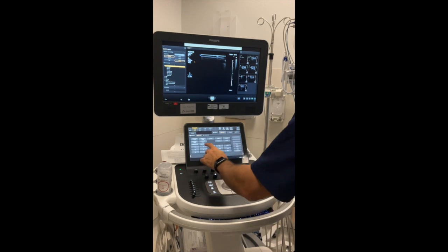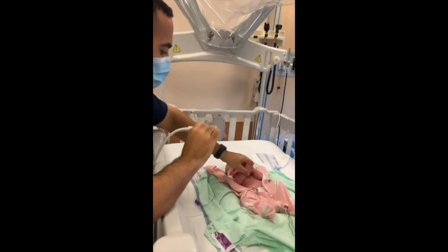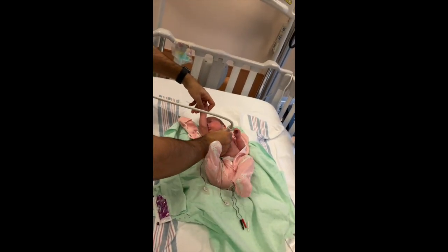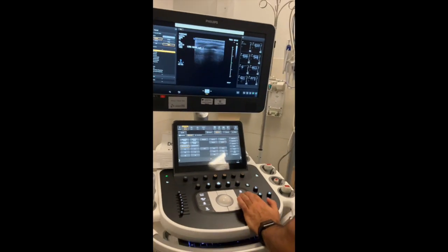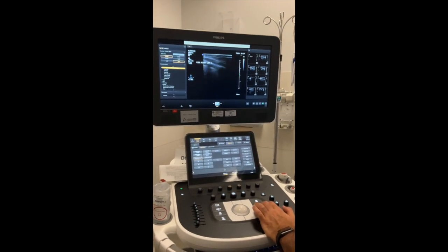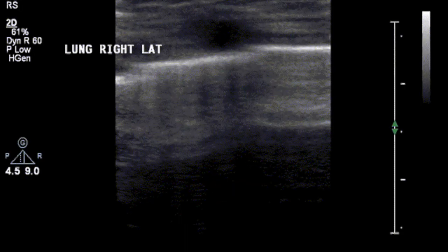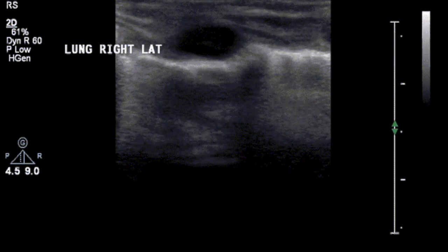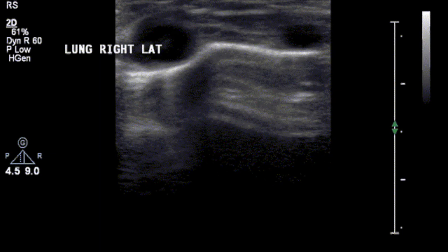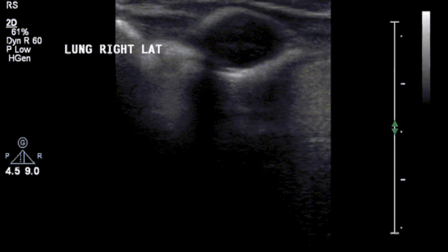For my last view, I label the right lateral. I go lateral, starting from the axilla and sliding to the diaphragm. I want to see my ribs and go down to the diaphragm area. Here we see the lateral acquisition with the sliding from the axilla to the diaphragm at the mid-axillary line. Just to note that we only need one acquisition of the clip and not multiple, as outlined during the video for demonstration.